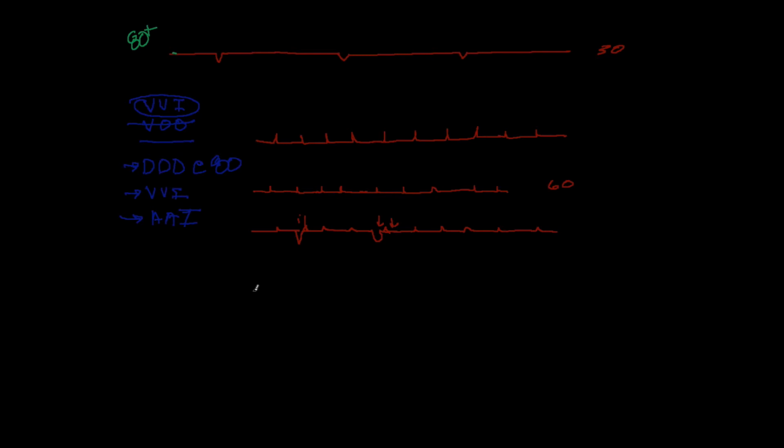You can test them out by just touching them to your tongue, and if it zaps really, really hard and you can't hold it there for more than half a second, chances are the battery's pretty good. But if not, you might have to refloat your pacemaker and make sure that it's capturing appropriately. And this applies for both temporary pacemakers as well as epicardial leads. Usually you have pretty good connections on epicardial leads, so you don't have problems with sensing, but it is a possibility.